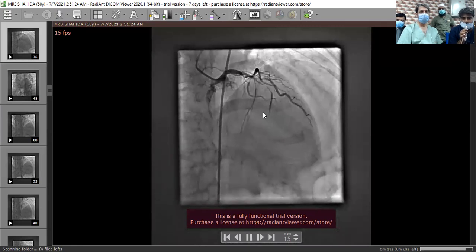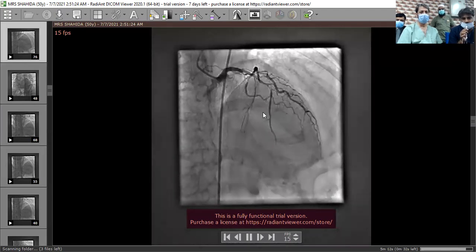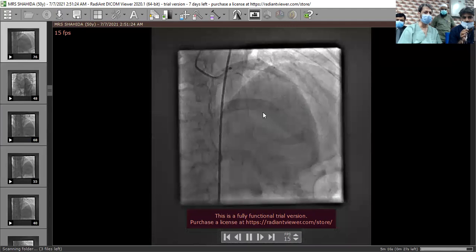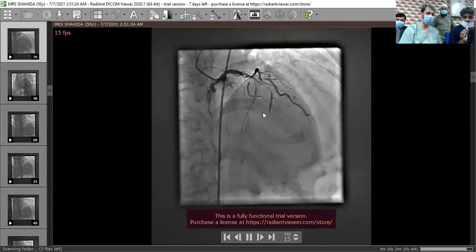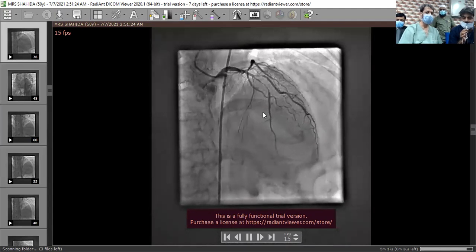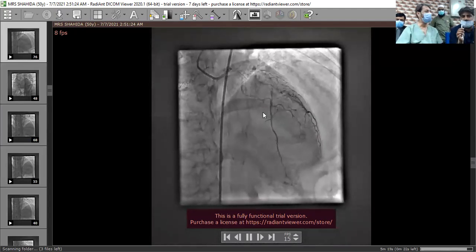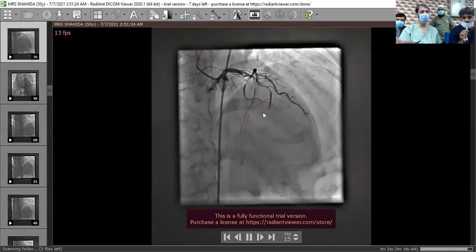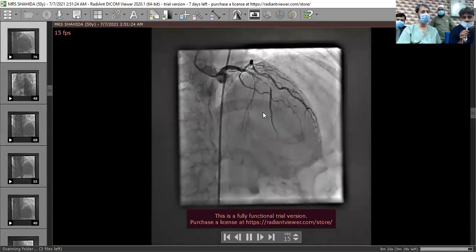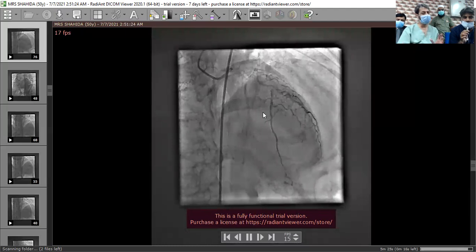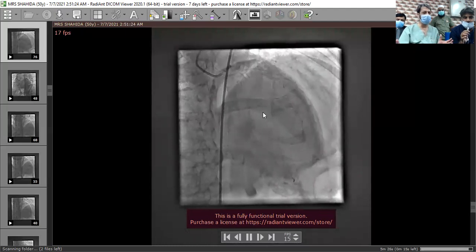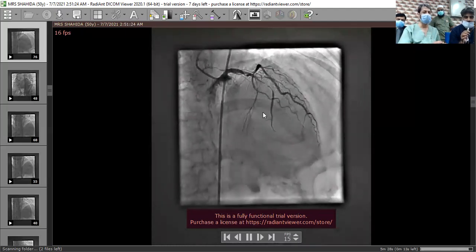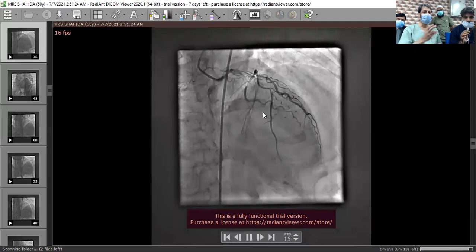There is TIMI flow and haziness in the lesion, which suggests this is the acute culprit. Out of the three lesions, the ECG is also guiding. Sometimes, like in inferior MI, you have to judge if you have disease in circumflex and RCA as well — determining which one is the culprit.